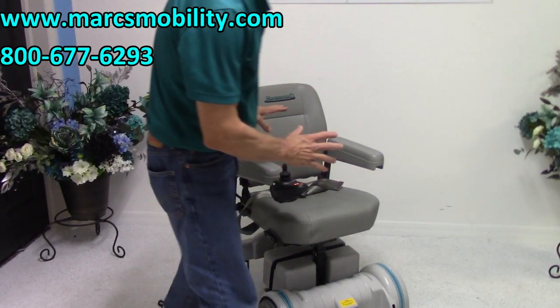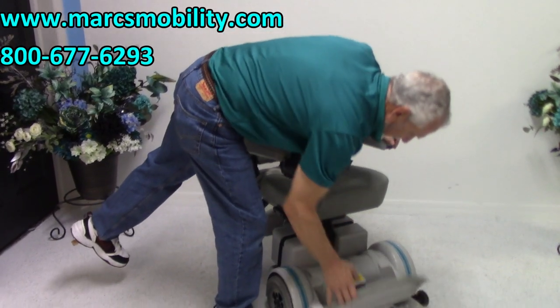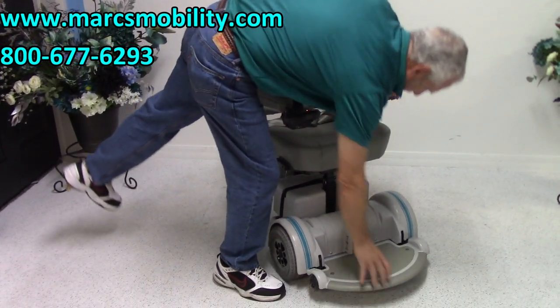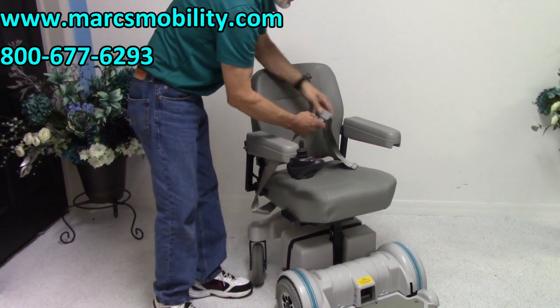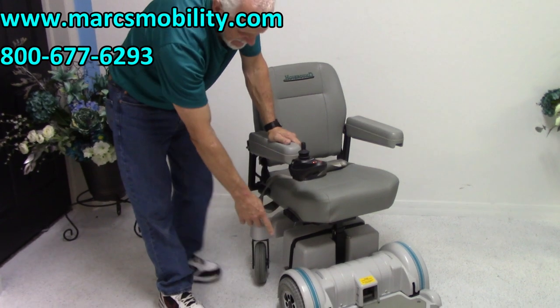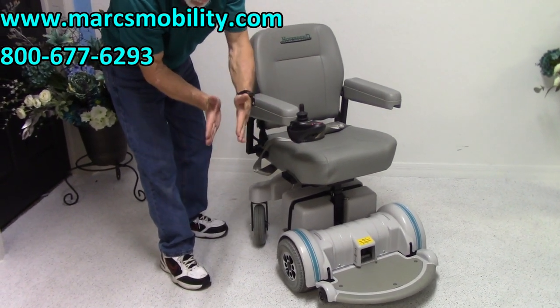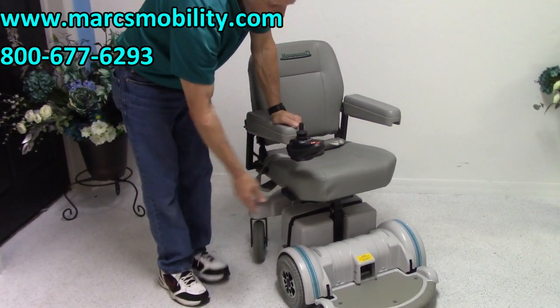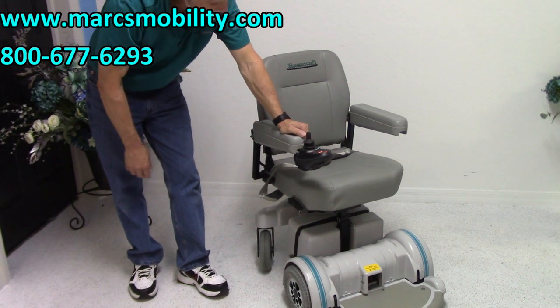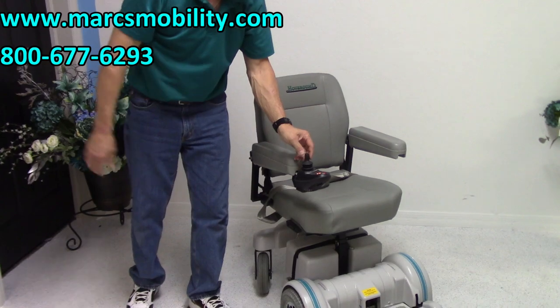So this is the Hoveround MPV5 Power Chair with a rounded footplate that flips up for easy exit. You've got the flip-up arms, the 18 by 17 seat, and the safety belt. You've got nine-inch knobby tires — they're really wide. They're not tall, but they're wide, which is what you need when you go in the grass. Nine-inch tires on both sides, and this chair is practically brand new, used for about three or four months at the most, and it's ready to go.